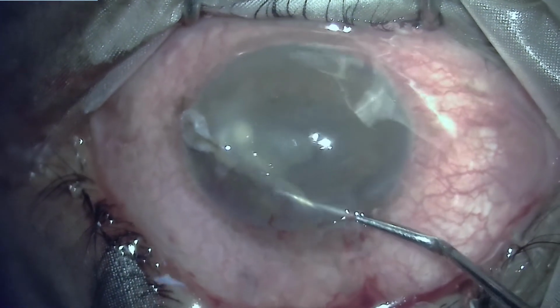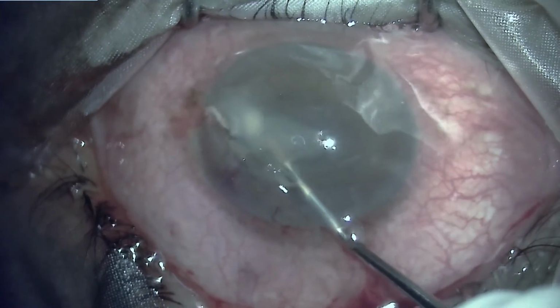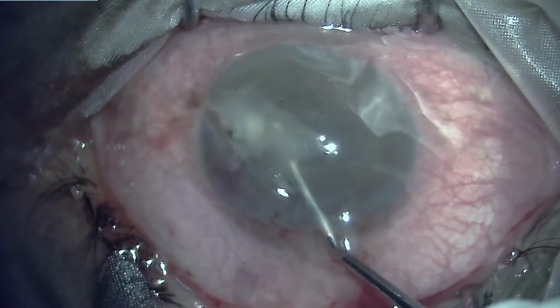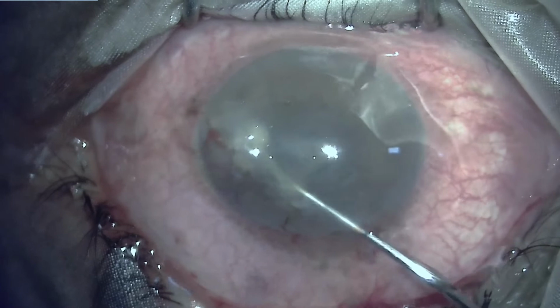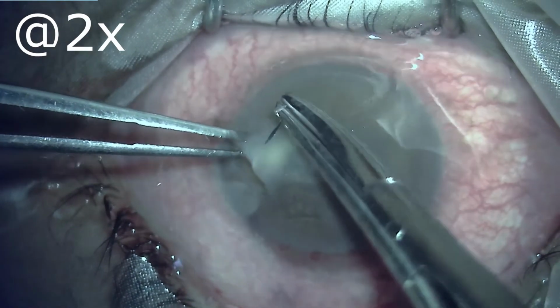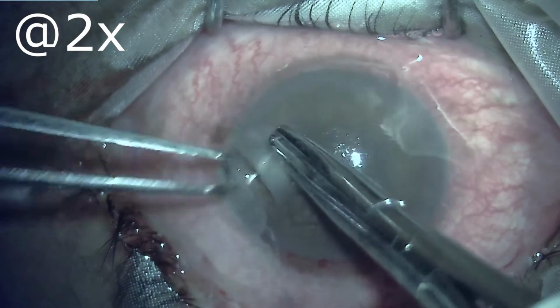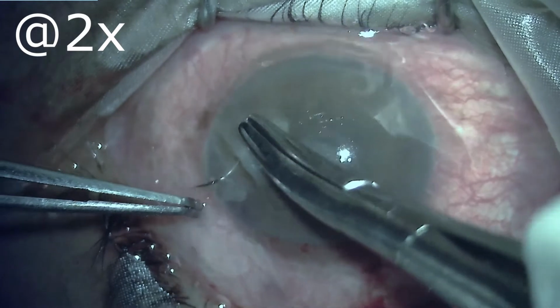Because the foreign body was very small and was a flying projectile, we had suspected the patient may have a retained, lodged intraocular foreign body. So a CT scan and ultrasound have already been done. Once the prolapsed tissue has been repositioned and freed from the wound, we proceeded to repair the cornea using 10-0 nylon suture.